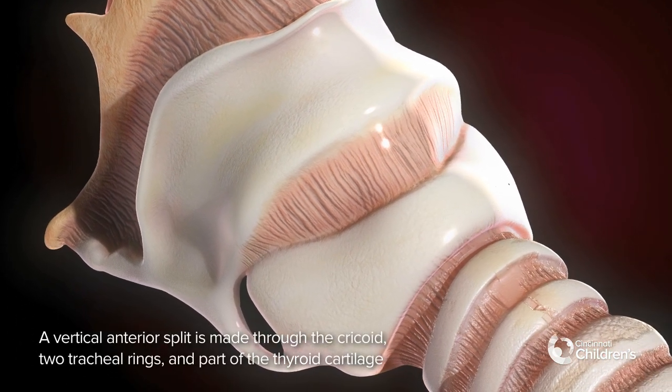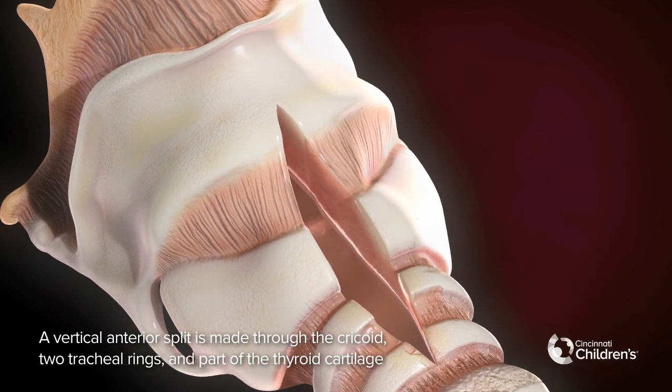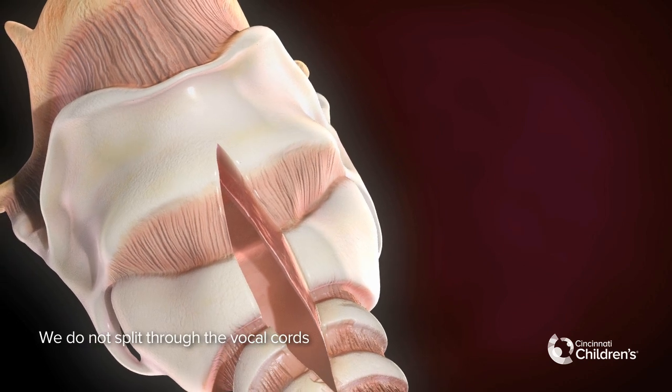A vertical anterior split is made through the cricoid, two tracheal rings, and part of the thyroid cartilage. We do not split through the vocal cords.